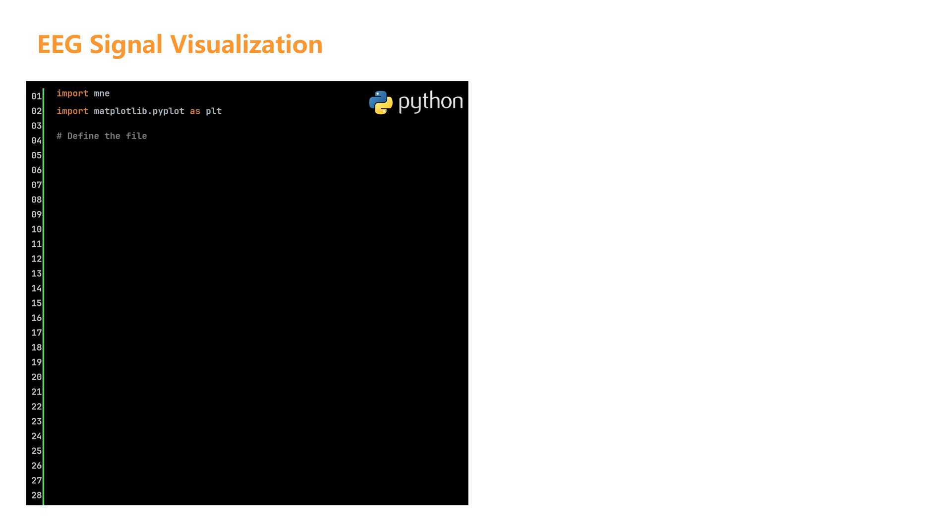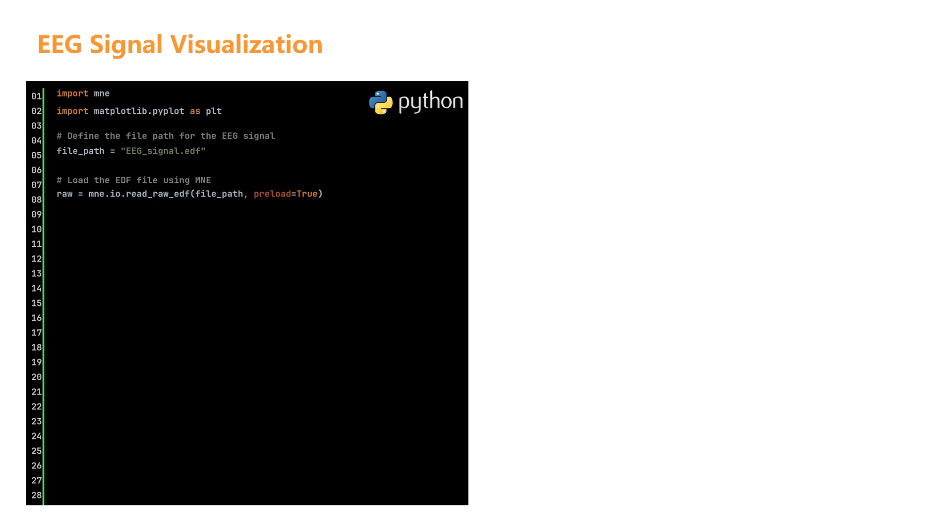Next, we define the file path for the EEG signal and load the data file. Here, we assume the file is in EDF format. The data can be loaded using the following code. When loading the data, we use the preload equals true parameter. This means the entire data is loaded into memory. While this might consume more memory, it can significantly improve the speed of subsequent data processing.